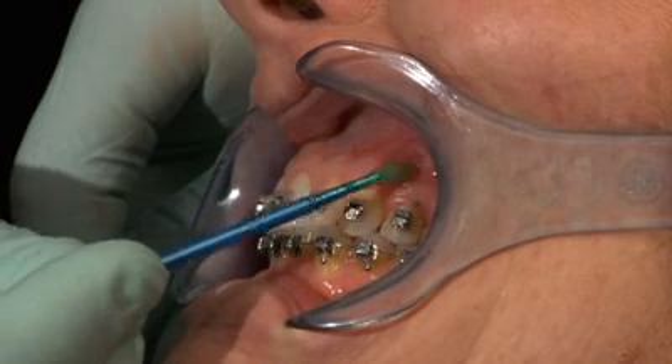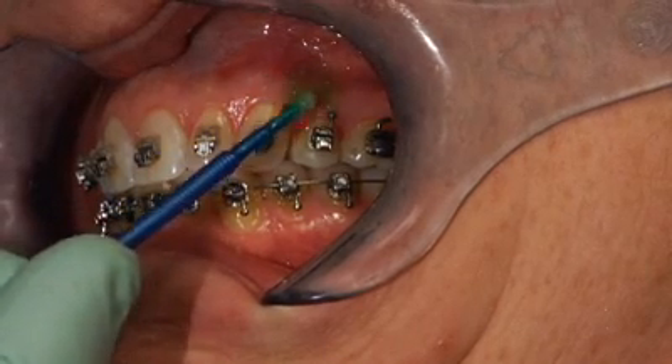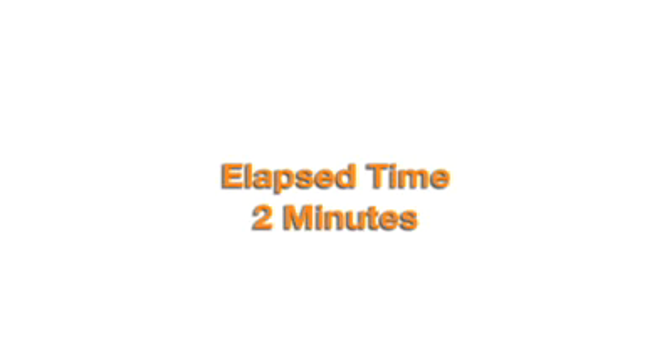Apply a small amount of topical anesthetic on the mini-screw placement site. Leave the anesthetic on for about 2 minutes, then wipe thoroughly.